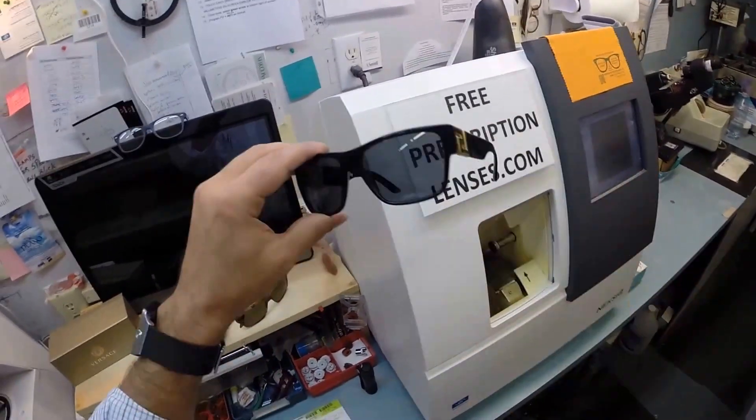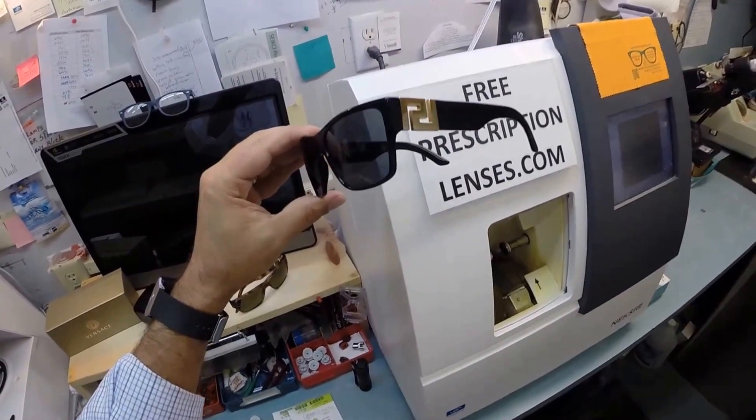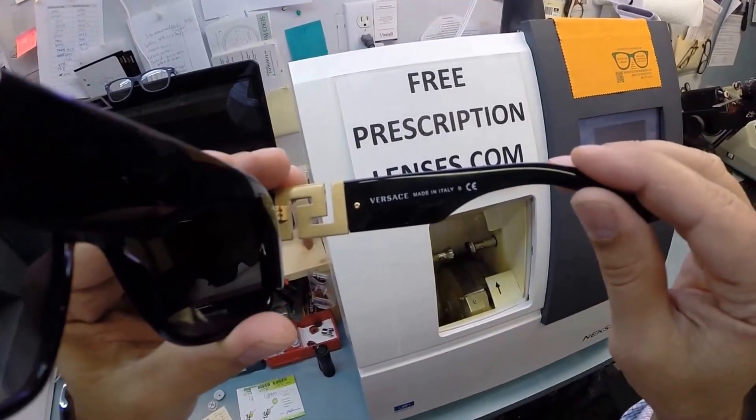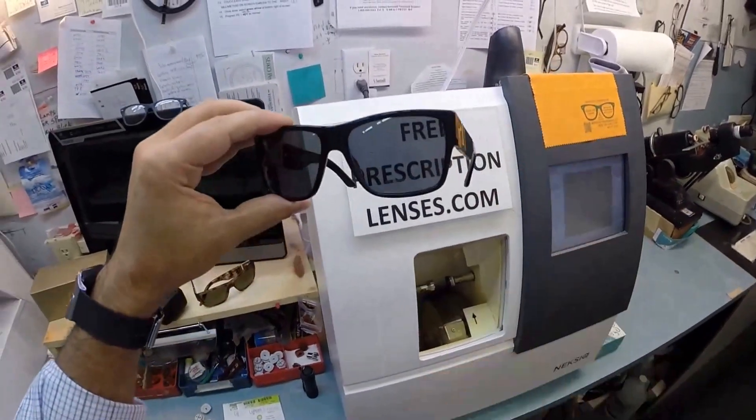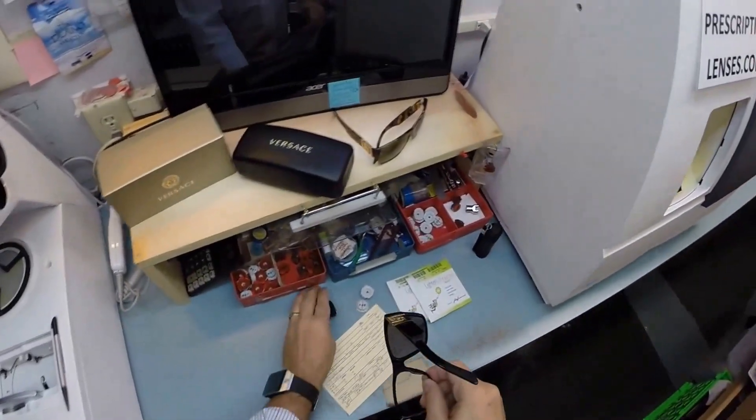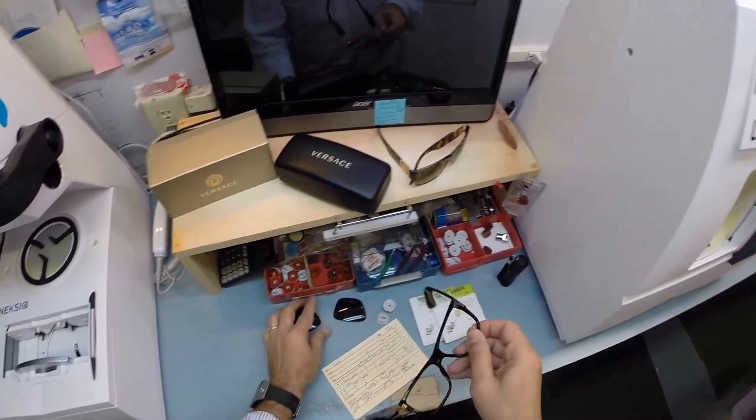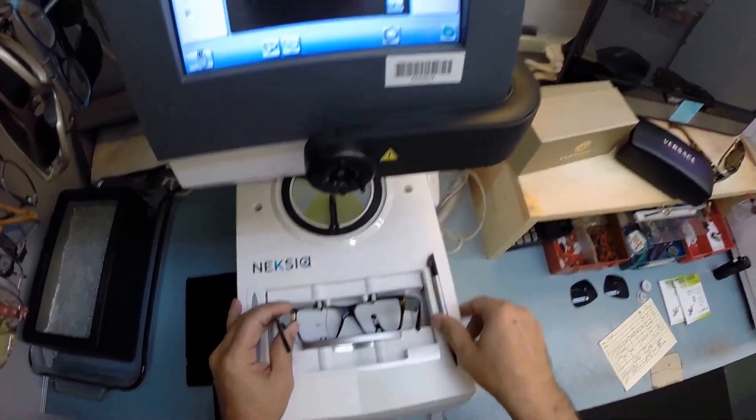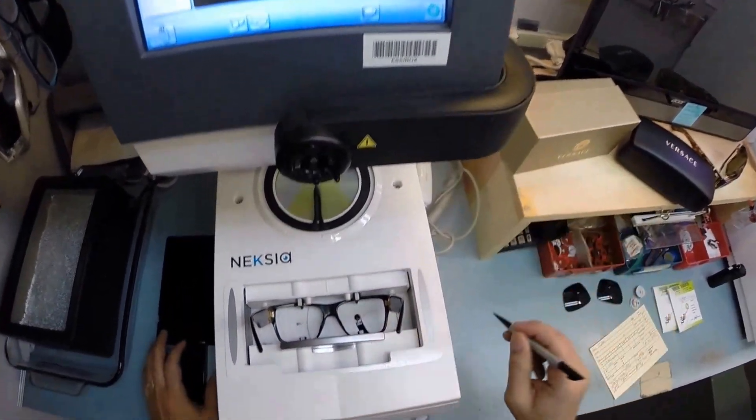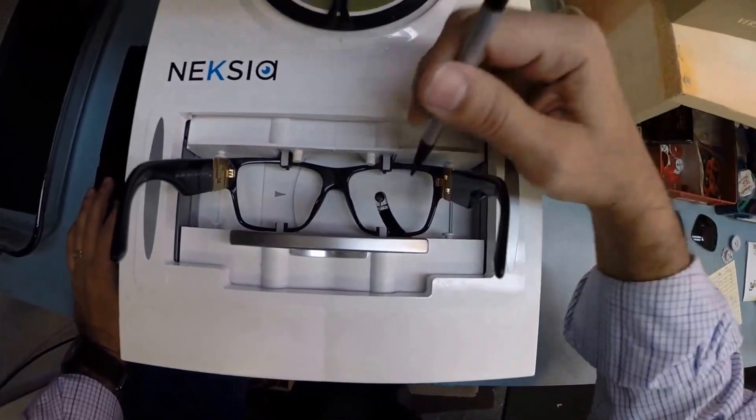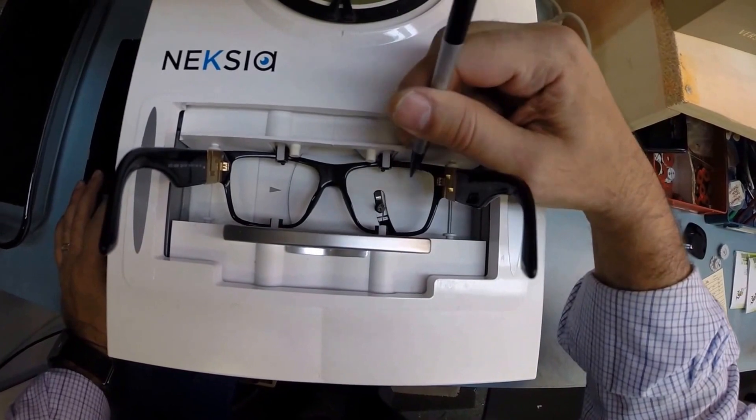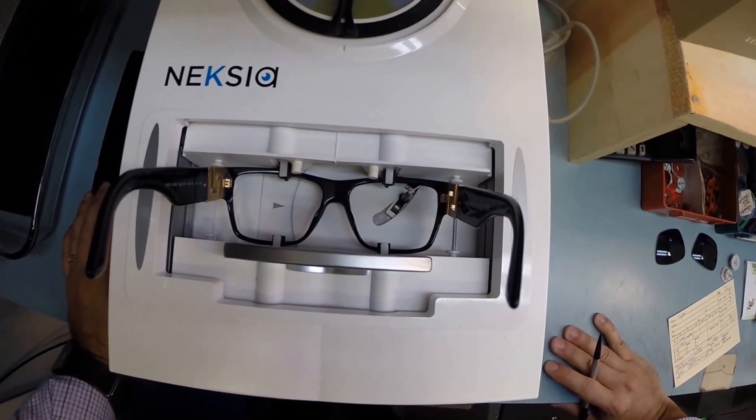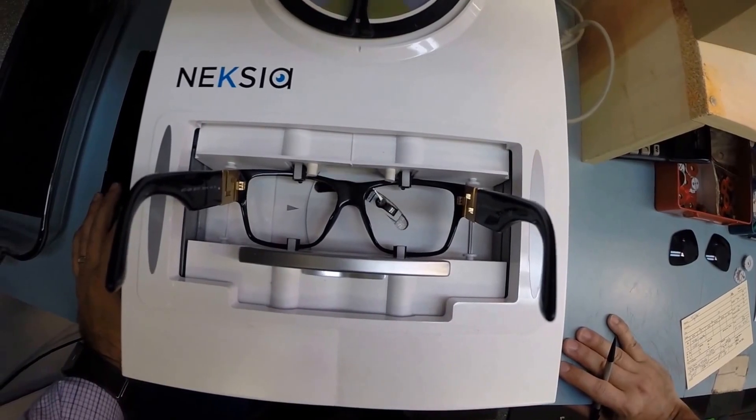This is the one that Biggie Smalls wore in so many videos and pictures. Versace, made in Italy. Let me begin and pop out the original demo lenses. I'm going to put the frame into the tracing element of my edger and hit start. This little stylus is going to trace the right side of the frame before doing the same for the left.